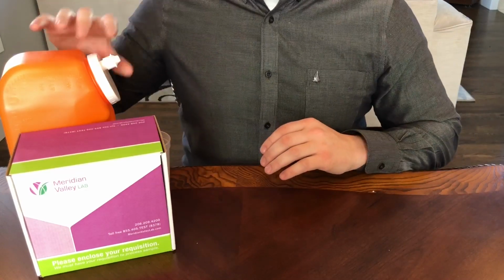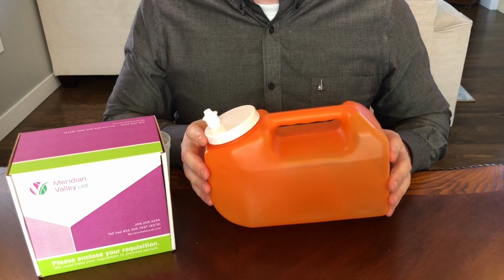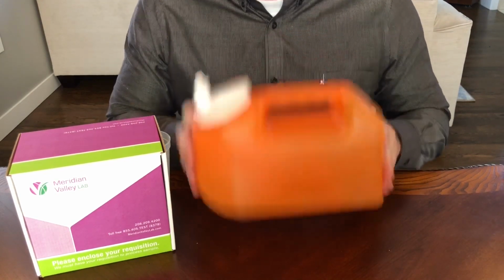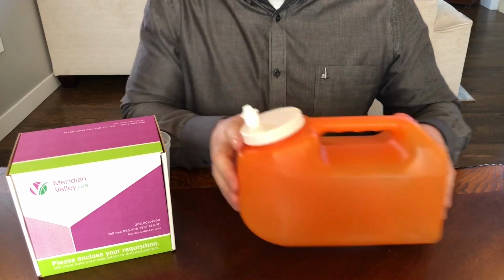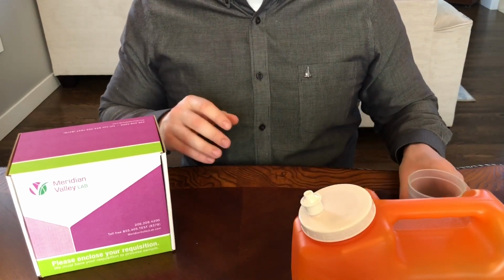Now to begin collection, take your kit and lay out the contents. In the kit, you should have one collection jug with boric acid tablet. The boric acid tablet acts as a preservative, so you don't have to refrigerate the sample during collection. You should also have one collection cup.